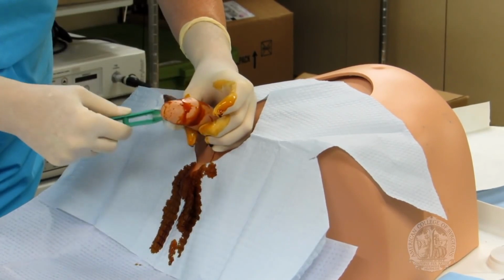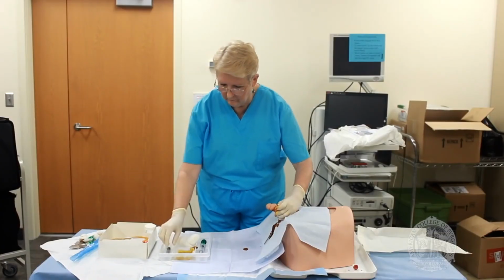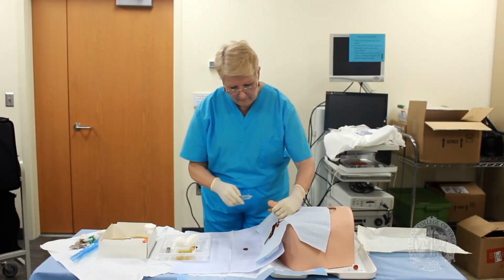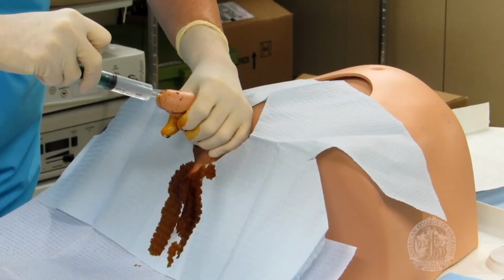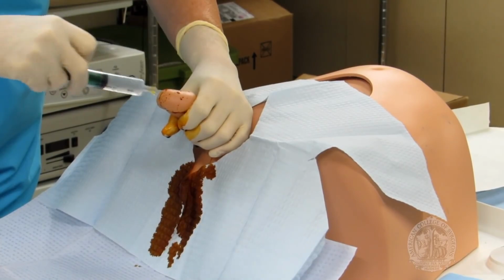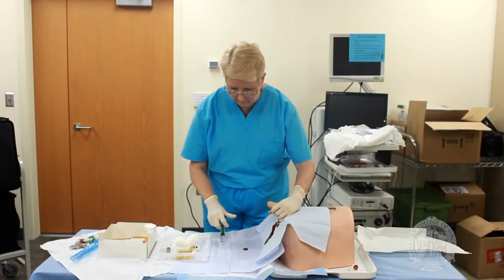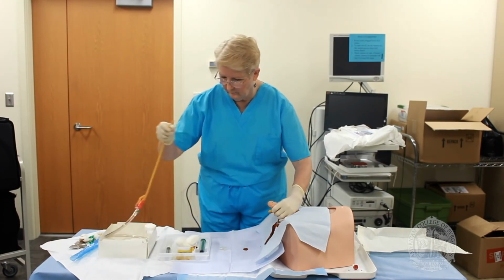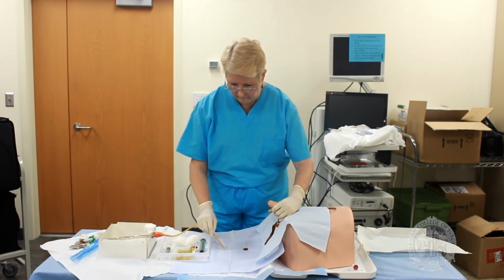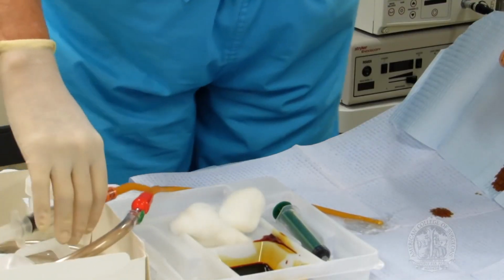Using 3 cotton balls, prepare the glans from the meatus towards the shaft in a circular motion. 2% lidocaine jelly can be injected directly into the lumen of the urethra via syringe, and squirt the rest of the lubricant onto the sterile field. Place the tip of the catheter into the lubricant and attach the syringe to the appropriate port.